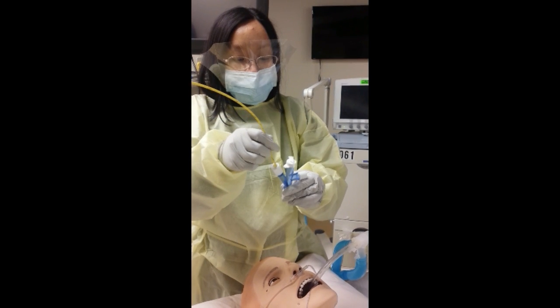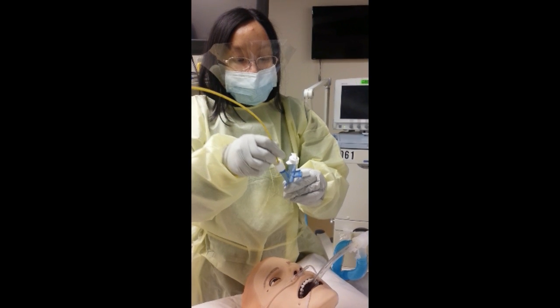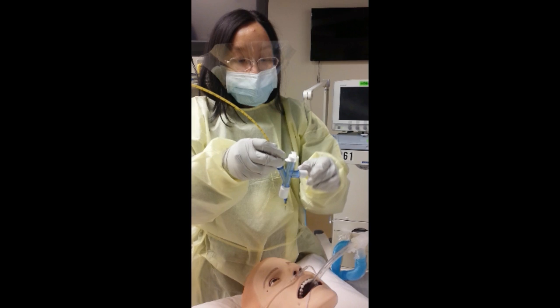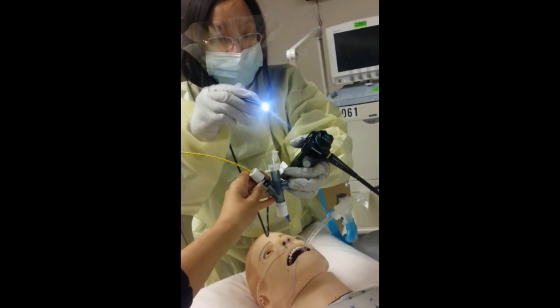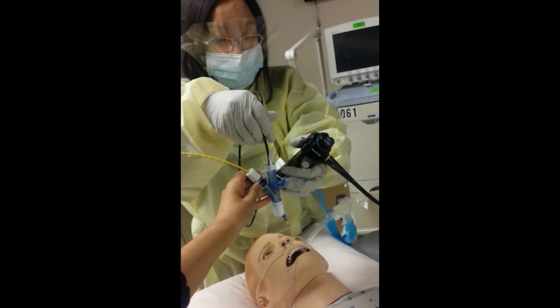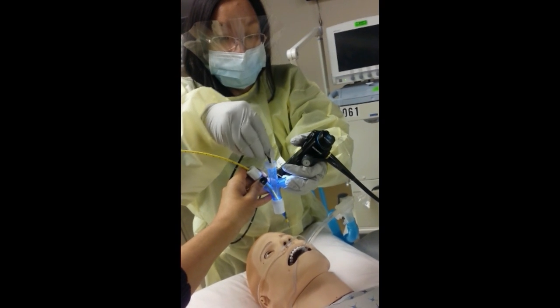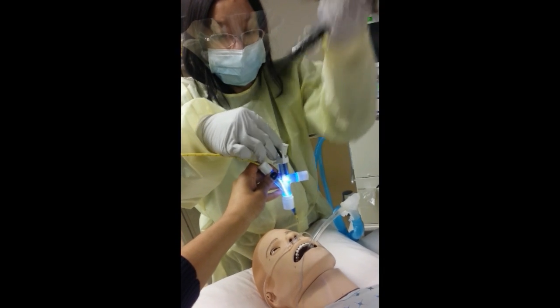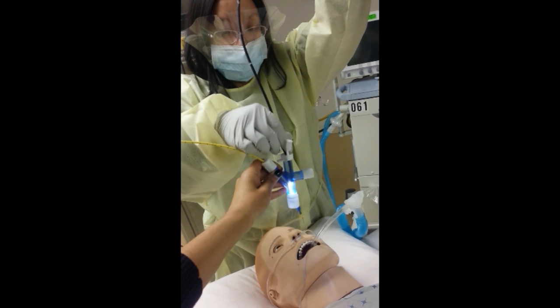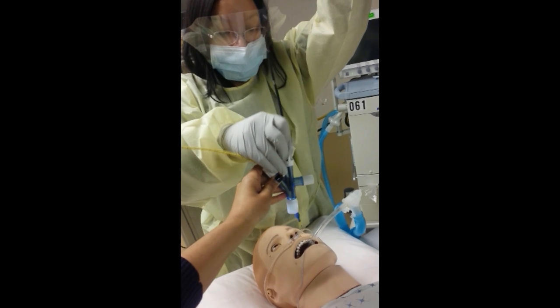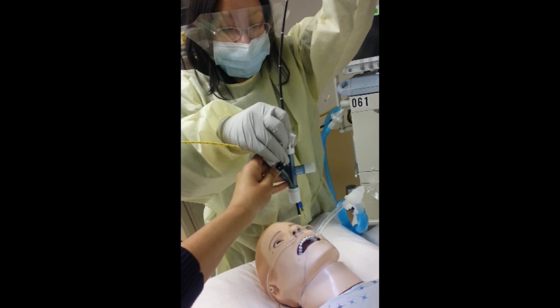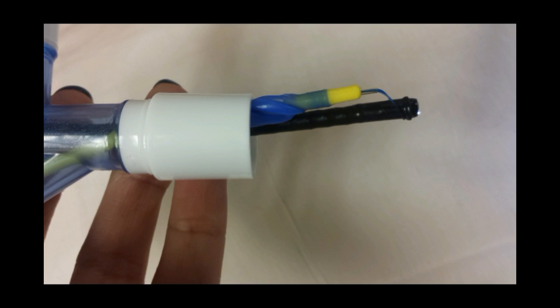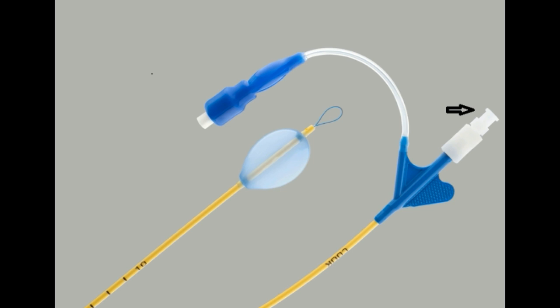First, insert the endobronchial blocker into the adapter. Then insert the bronchoscope. Then you will manually loop the snare around the end of the scope and tighten by pulling the proximal end of the snare loop. This is how they should ultimately appear.